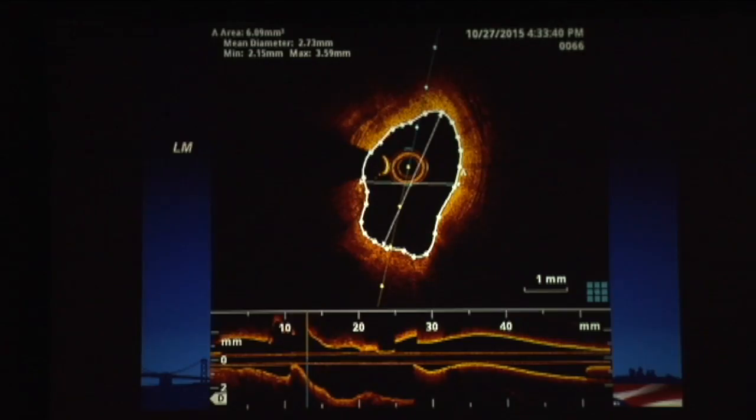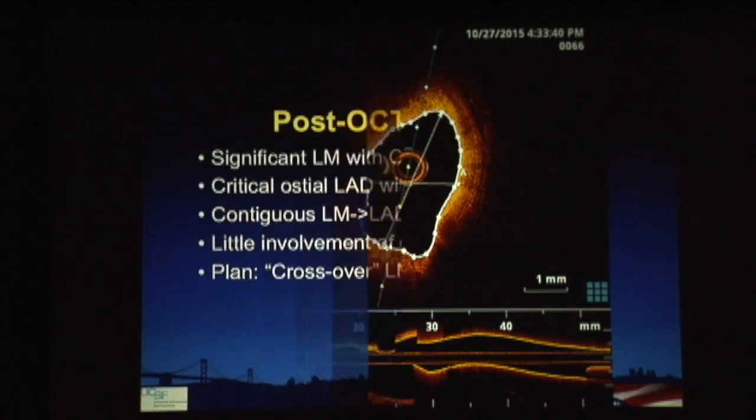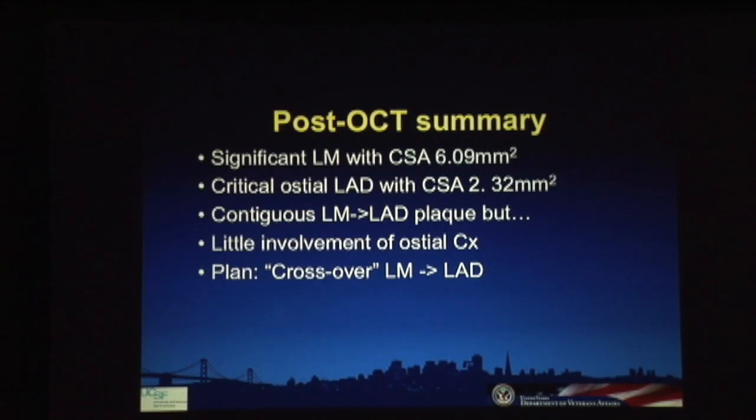And the important thing was on the pullback, if you saw it when I went by quickly, the plaque is more or less contiguous, straight across. And so our impression at that time was, as I said, the cross-sectional area of the left main was significant at 6.09. LAD was critical at 2.32. It was a contiguous plaque, but as we saw the circumflex on the pullback, there was very little involvement of the ostial circumflex, so it seemed particularly well suited to a crossover technique, so stenting left main to LAD and leaving the circ unstented. So just quickly run through that.